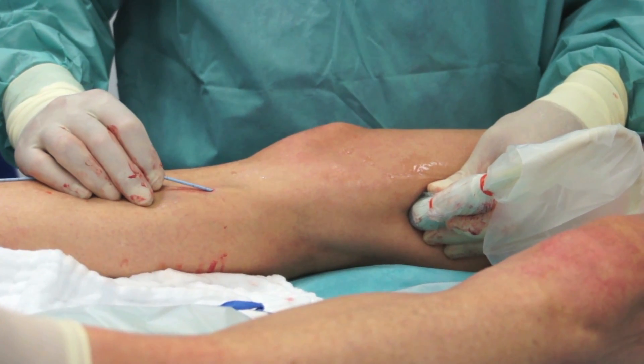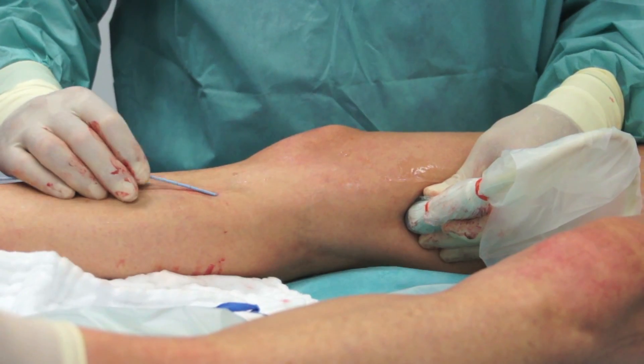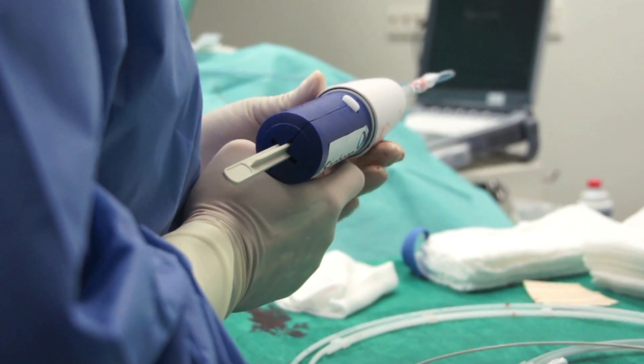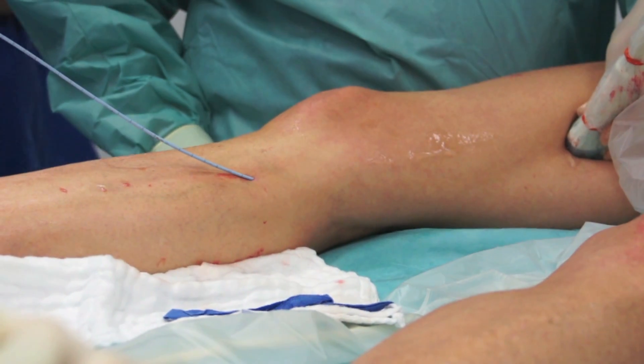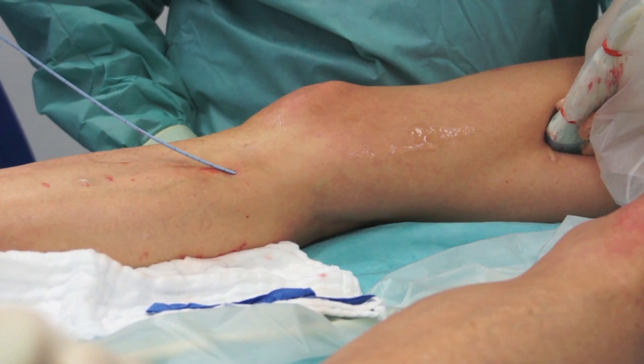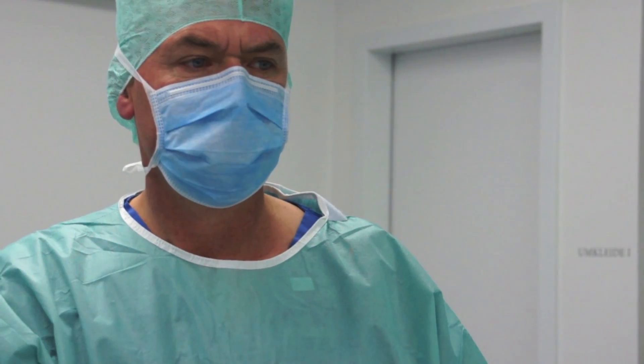After delivery you can see that Dr Alm is withdrawing the catheter very precisely three centimetres and his nurse is squeezing the trigger to deliver the superglue. Again, firm pressure leads to bonding of the vein.